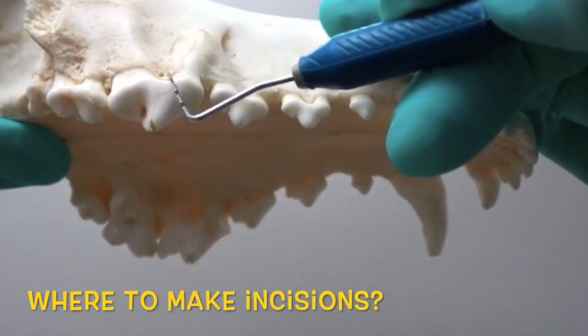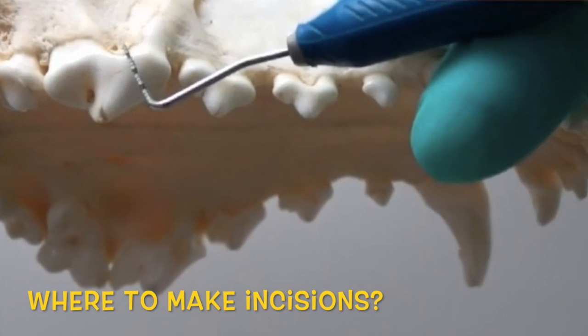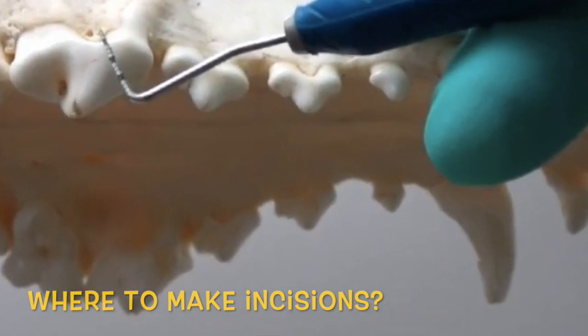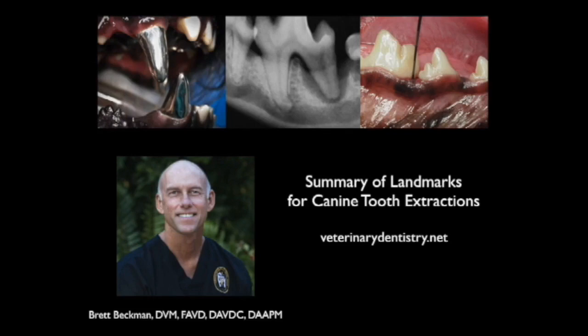Where do we make our incisions for our flaps? We're going to show you a video that will outline exactly where we make those flaps. Here we'll discuss the landmarks for surgical extractions in dogs when we're talking about flaps and sectioning.